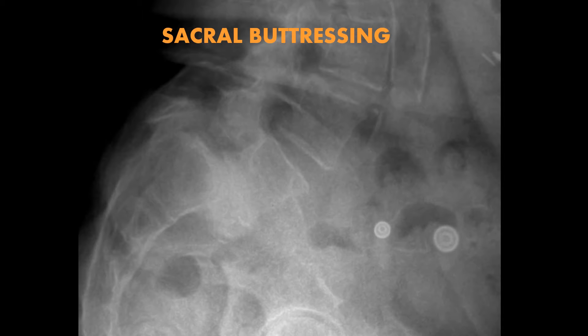Here's one more example of sacral buttressing. In this case you can see a grade 3 spondylolisthesis of L5 in relation to the sacrum with a huge mass of osteophyte formation or bone growth seen anterior to the sacrum. This is present in compensation for the forces and pressures placed on the sacrum due to the anterior slippage of L5, and it can be a sign of instability.